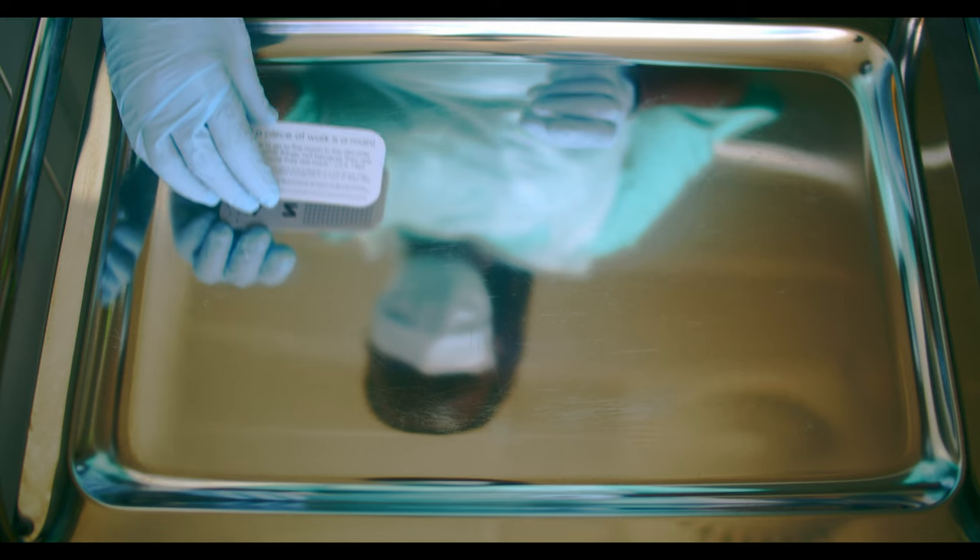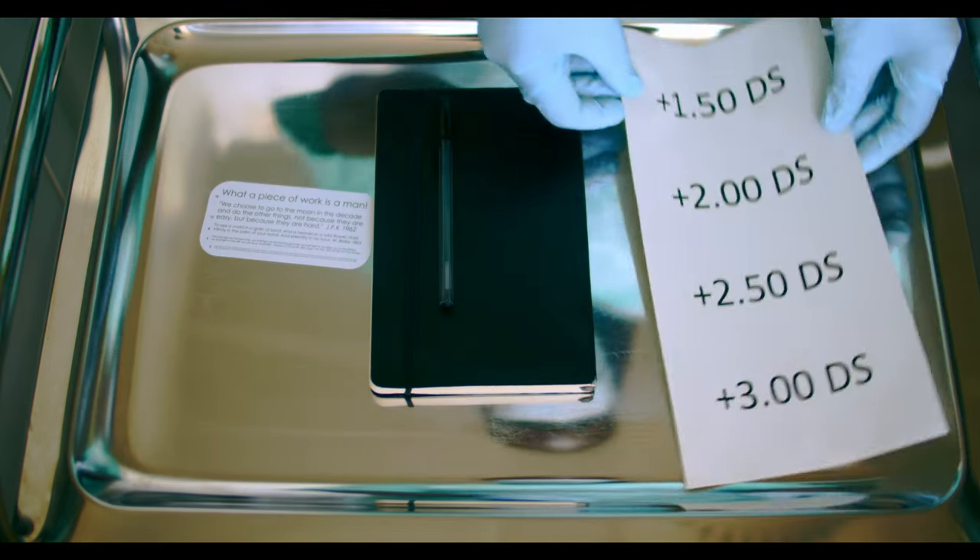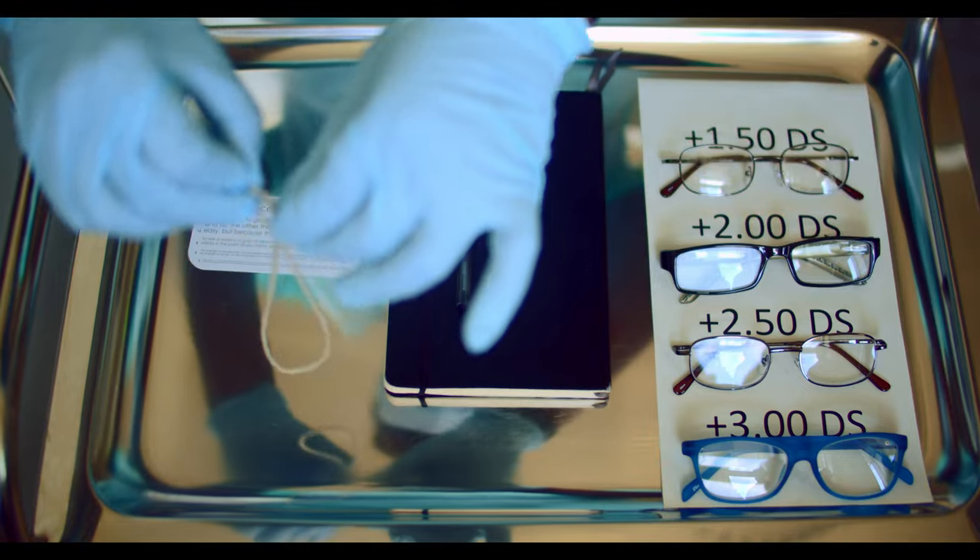You will need a near vision chart, pen and clinical notes, a range of reading glasses, and a 40cm long piece of string.